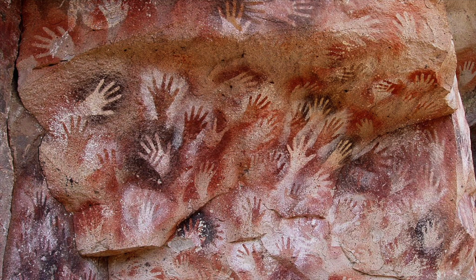You can kind of think of X-rays as like those ancient cave paintings where people put their hand against a cave wall and blew pigment towards it, creating this image of their hands. The pigment is like the X radiation that makes it to the film, and the hands are where those X-rays were blocked from reaching the film.